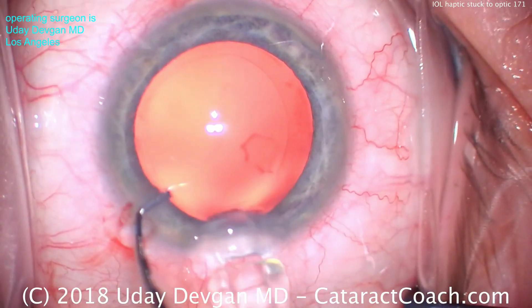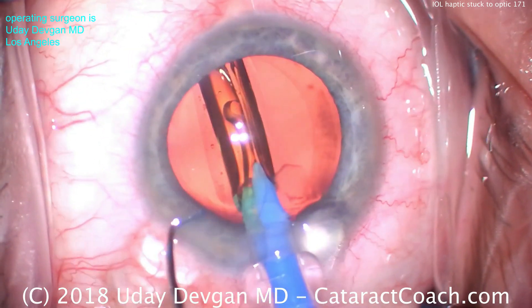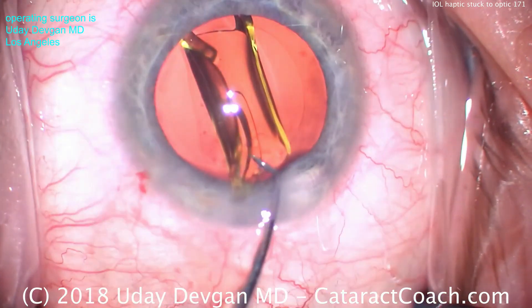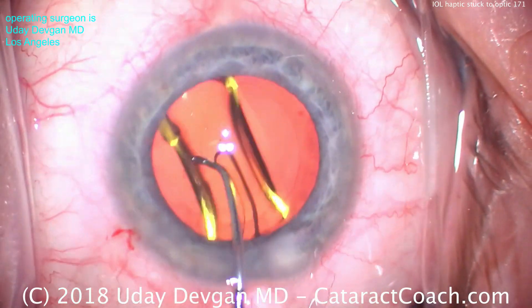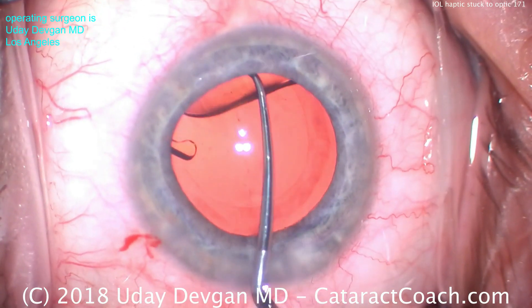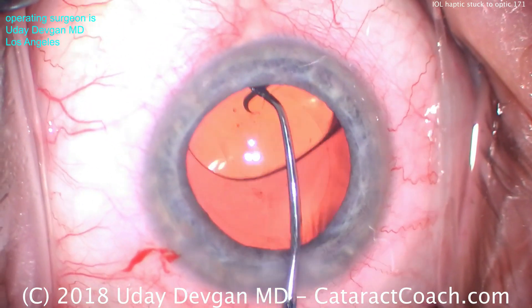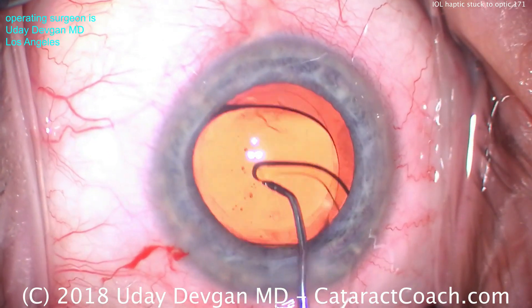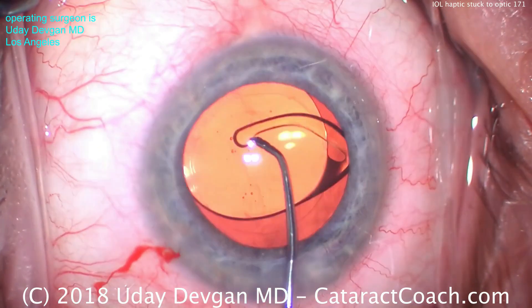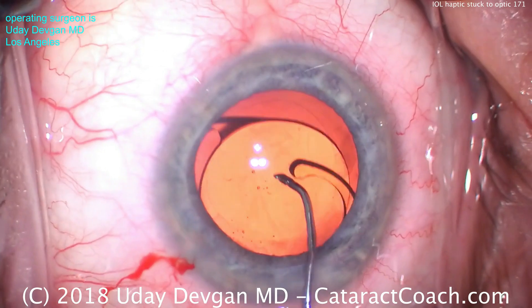This is a throwback video from 2018. Look at this eye — going in the eye nice and easy, just as usual, totally routine case. We'll get this delivered, put it in the bag, rotate around, and those haptics should get freed up pretty easily. Remember, this hydrophobic acrylic material is a little bit sticky or tacky, and with not enough viscoelastic you can see that one haptic is kind of stuck to the optic. We can use our chopper going back and forth to help free it up. This is what happens most of the time — it's pretty straightforward. There it is, finally released.